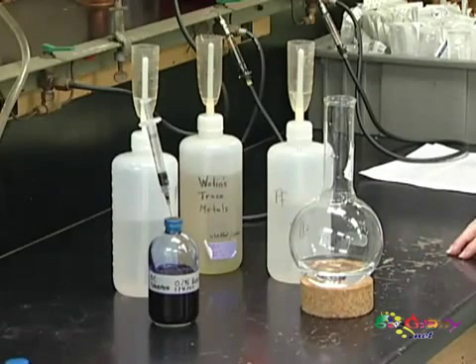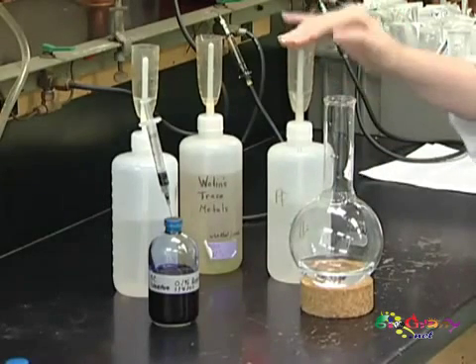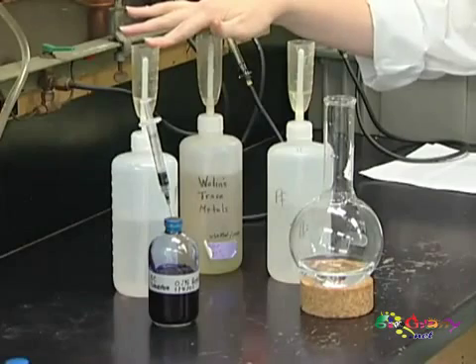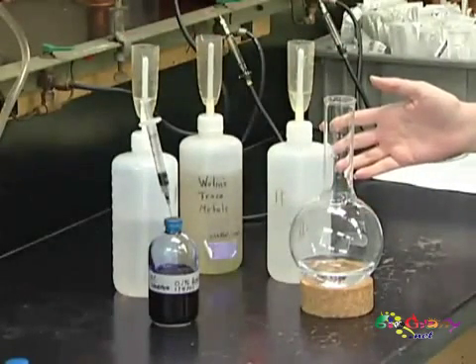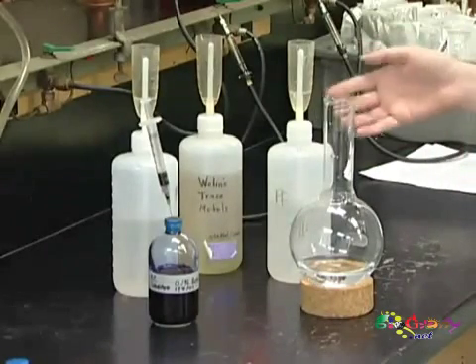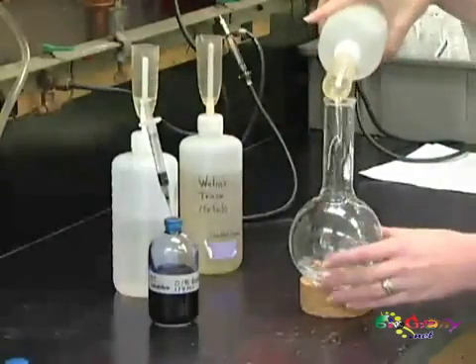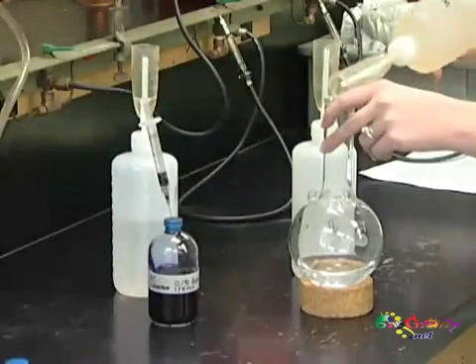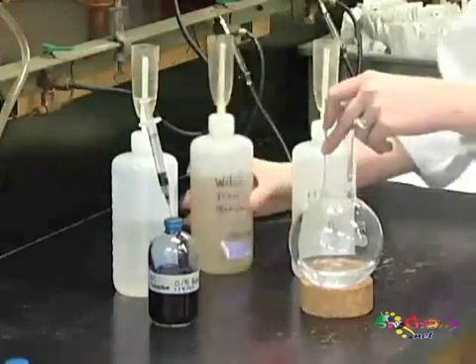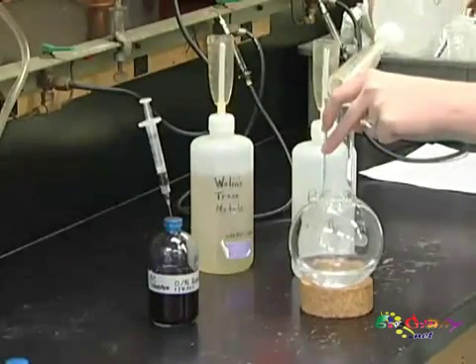Making anaerobic media is very similar to making aerobic media when you're first starting out. We're going to have minerals, metals, and vitamins that we're going to add in. In our lab, we like to keep larger stock solutions of these so that our media can be consistent from one experiment to the next. So I'm going to add these into our water, and I have 10% more water in there than the recipe calls for so that we'll have extra whenever we boil.